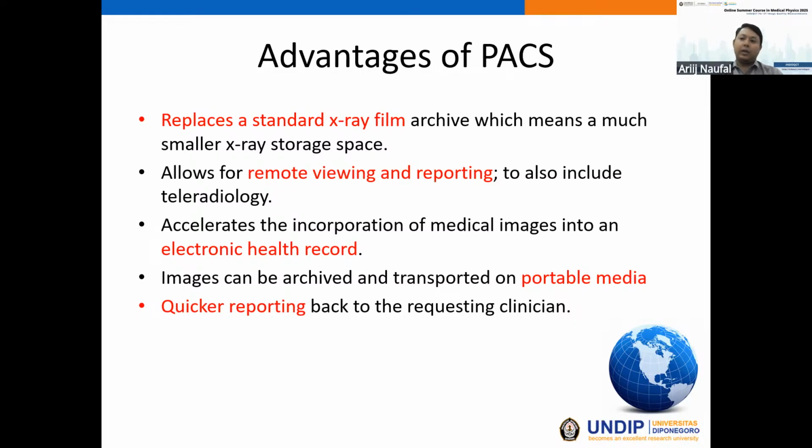But it also depends on the PACS system configuration. It also allows for remote viewing and reporting, and includes teleradiology, so the examination can be delivered from far away. It doesn't have to be in the same network or in the same place. So many hospitals can view images if configured correctly.